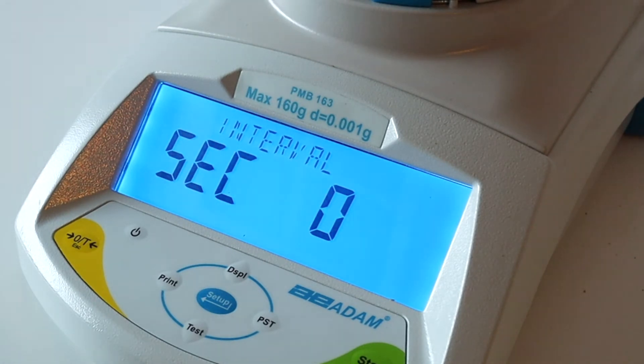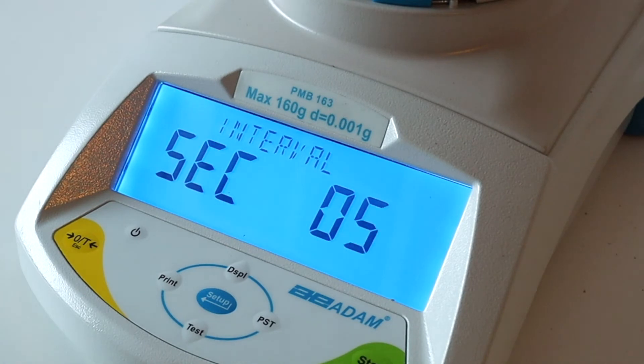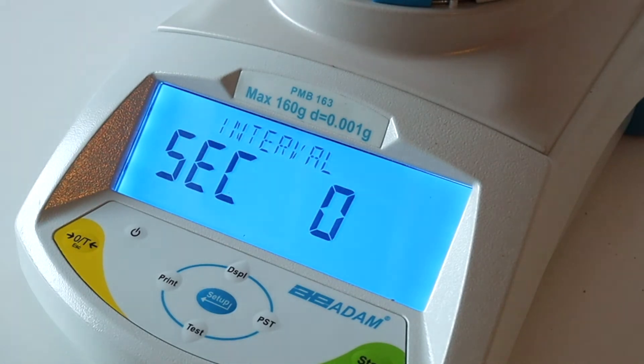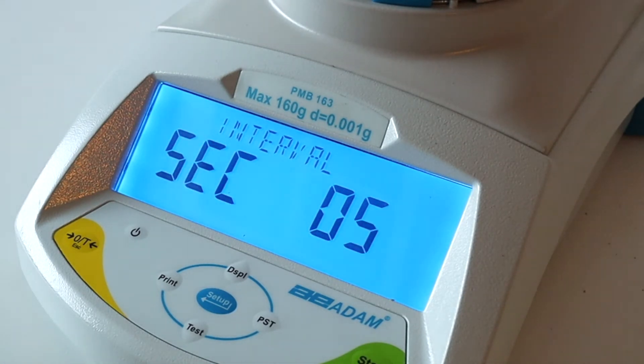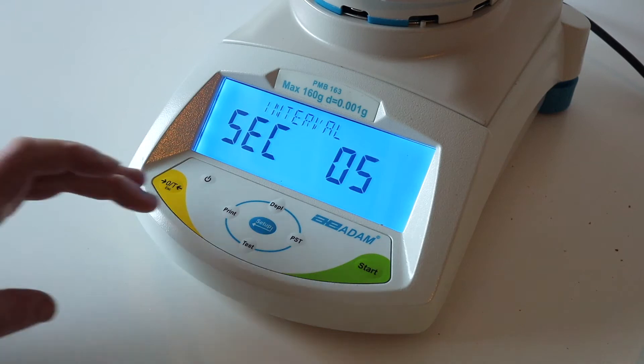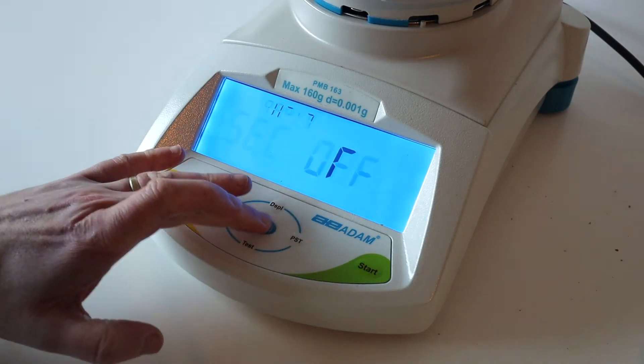Interval is how frequently data is sent from the PMB to your printer or PC for recording. This can be ignored if your PMB is not connected to a PC or printer.